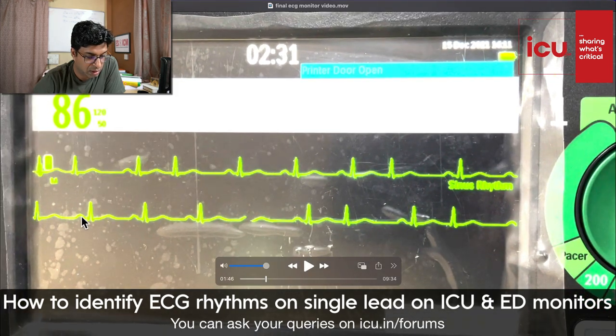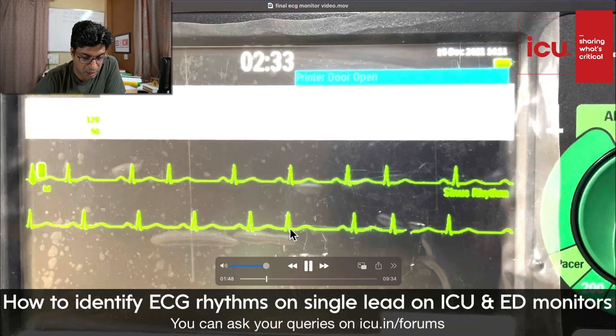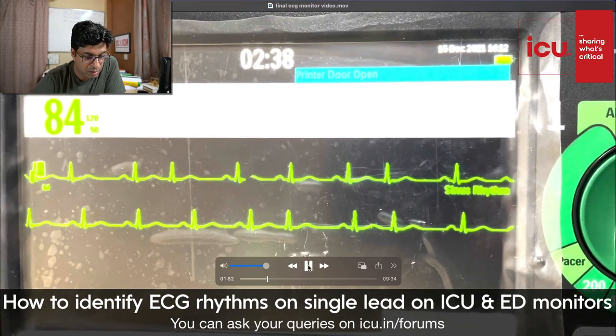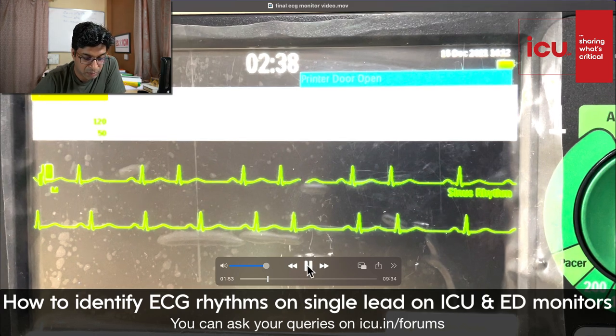Okay, so this is sinus rhythm. Again, junctional complex, premature junctional complex. Okay, this is also followed by a pause. You can see here, there is a sinus rhythm, there is a premature junctional complex, and there is a pause, and then the scheduled next beat.